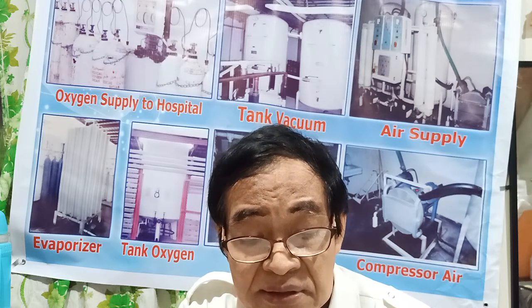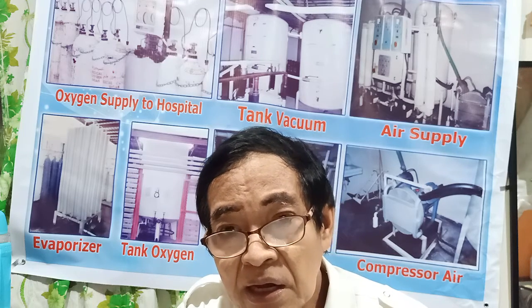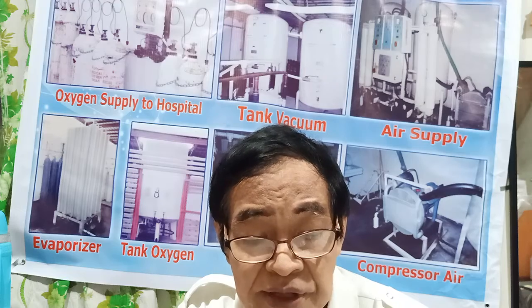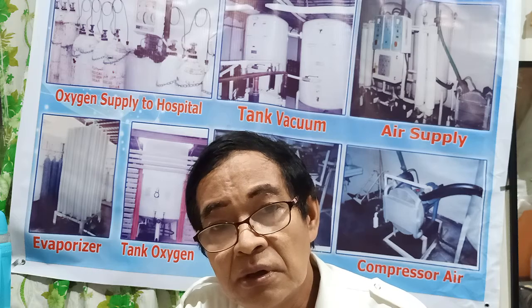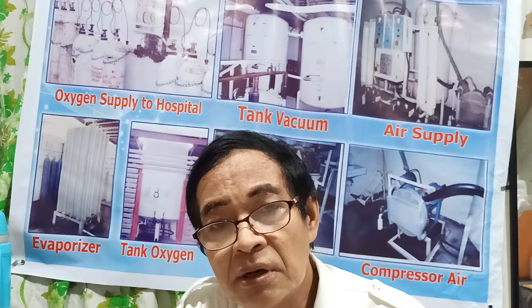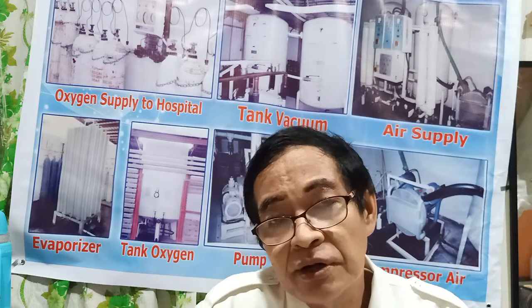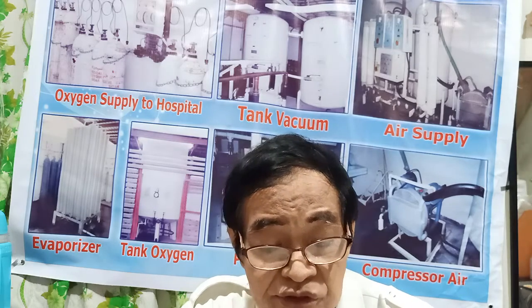I mean that the measure of the pipe is 8 mm. That is required for the technicians of maintenance operation of the hospital. The tank pressure. Yesterday I wanted to discuss tank pressure.